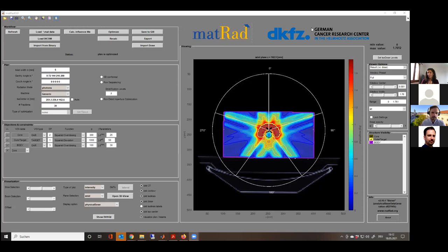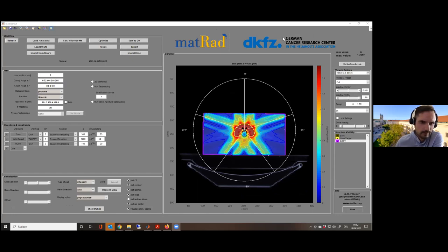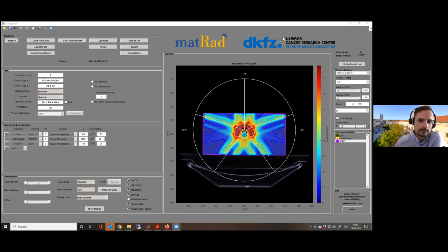Regarding the target dose value of 50 — yes, that's in Gy. 50 divided by the number of fractions gives the dose being optimized per fraction. For those running matRad on Mac: if you get an error that iPopt cannot be executed, go to System Preferences > Security & Privacy tab and allow the iPopt optimization function.